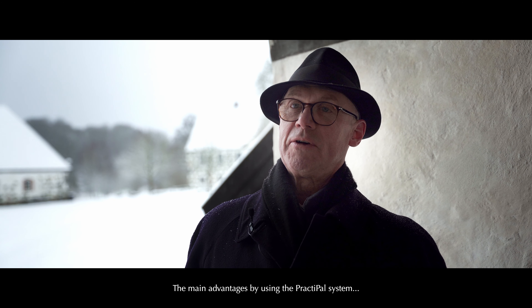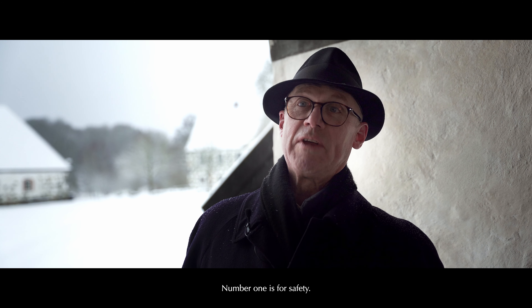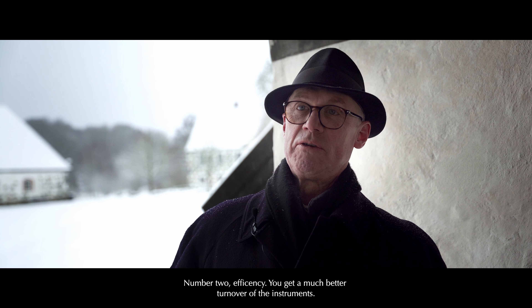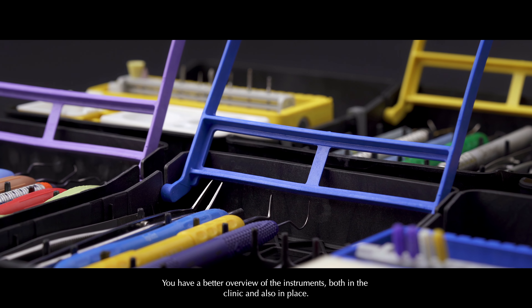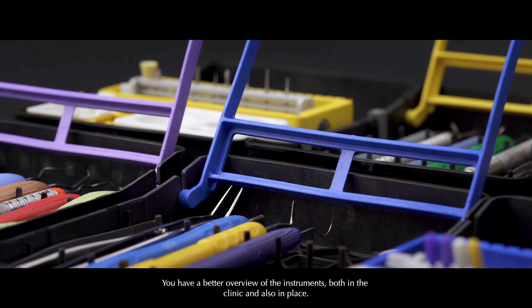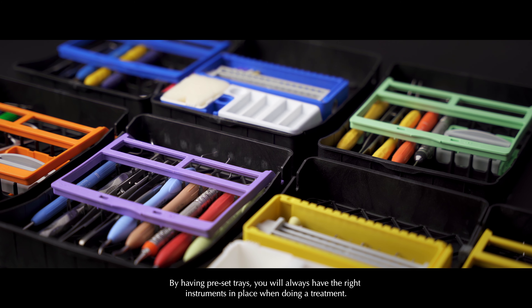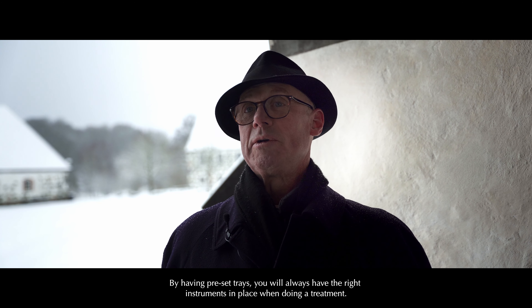The main advantages of using the PractiPal system: number one is safety. Number two, efficiency — you get a much better turnover of the instruments. You have a better overview of the instruments, both in the clinic and also in place. And by having pre-set trays, you will always have the right instruments in place when doing the treatment.